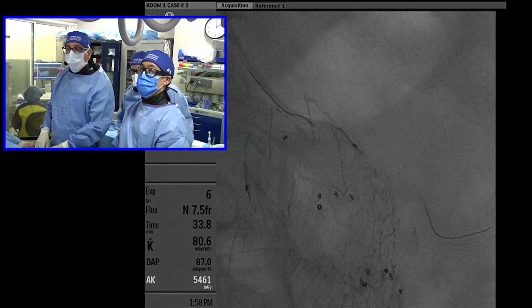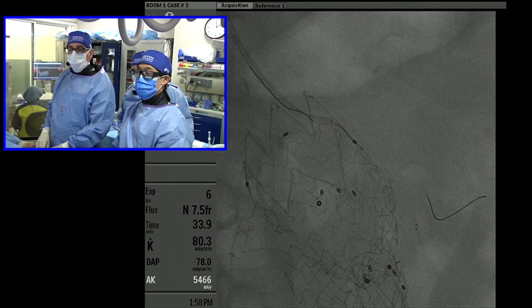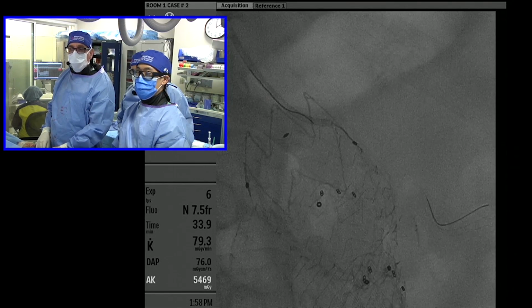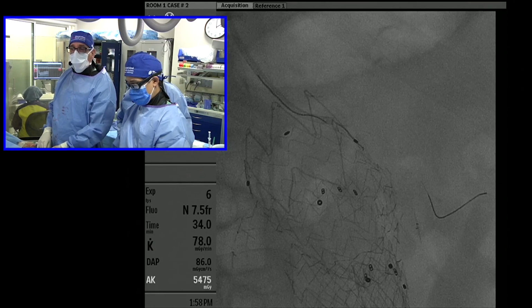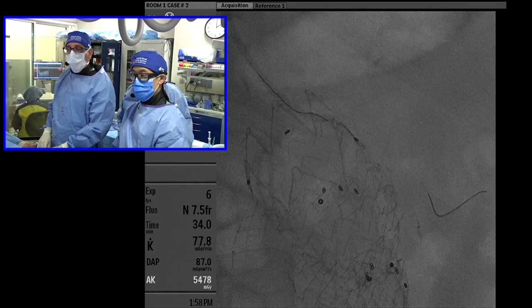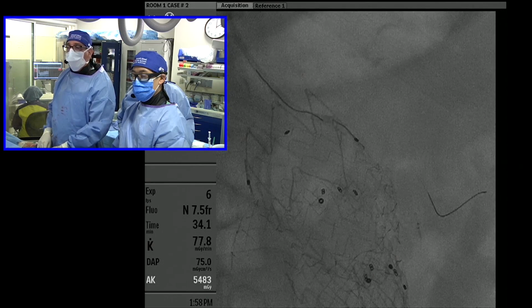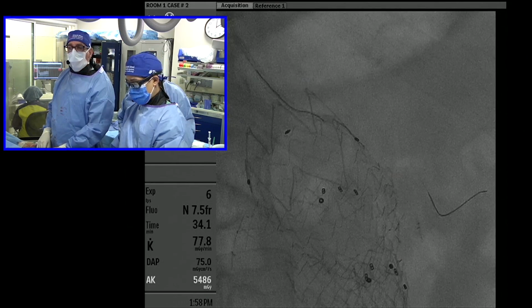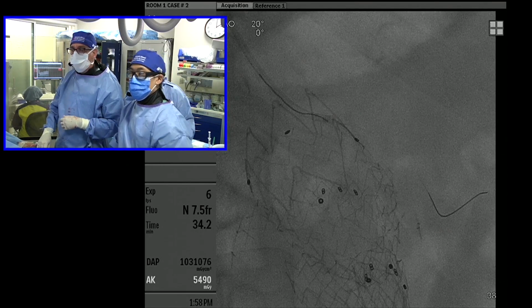Okay. We had a lot of very heartfelt, serious conversations with our surgical colleagues, and there's a lot of things that we learned. I'm going to ask everyone to look at a bunch of angiographic images here. Can we look at run number 6, please? Can we show that, please? I'm going to stop for a second.